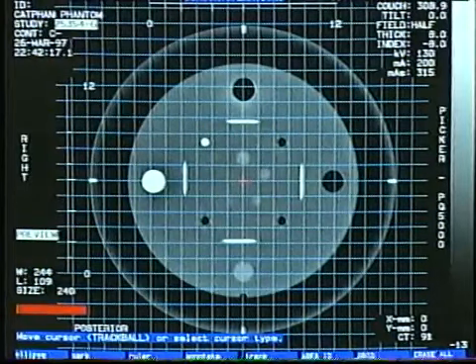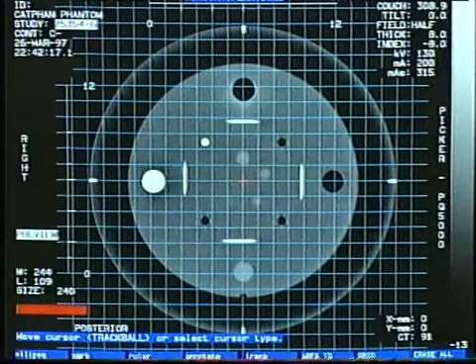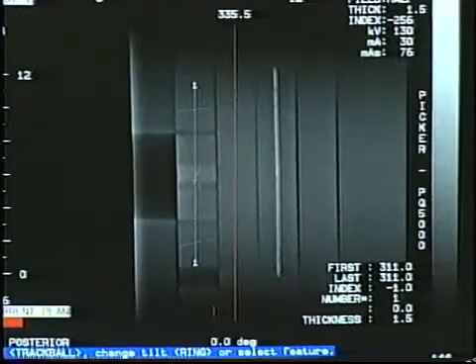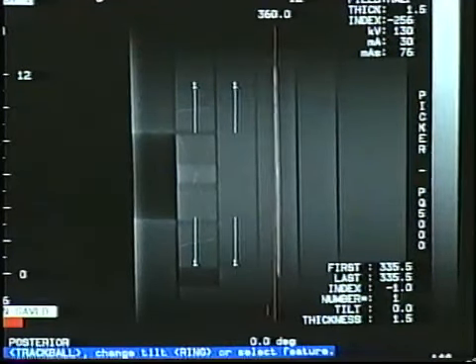Test these by selecting and scanning the center of the slice section 1. Evaluate the alignment of the wire ramps in these images. After the Phantom alignment has been verified, select the appropriate module locations for your Catphan model and scan the remaining test modules.